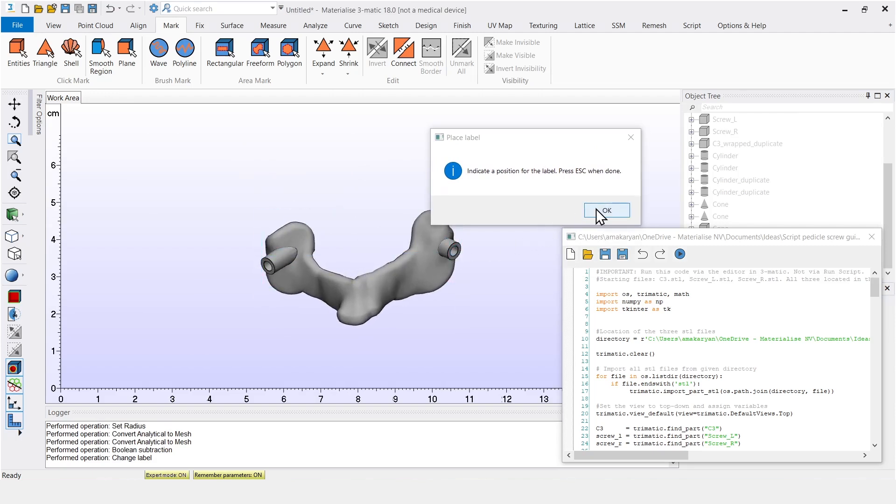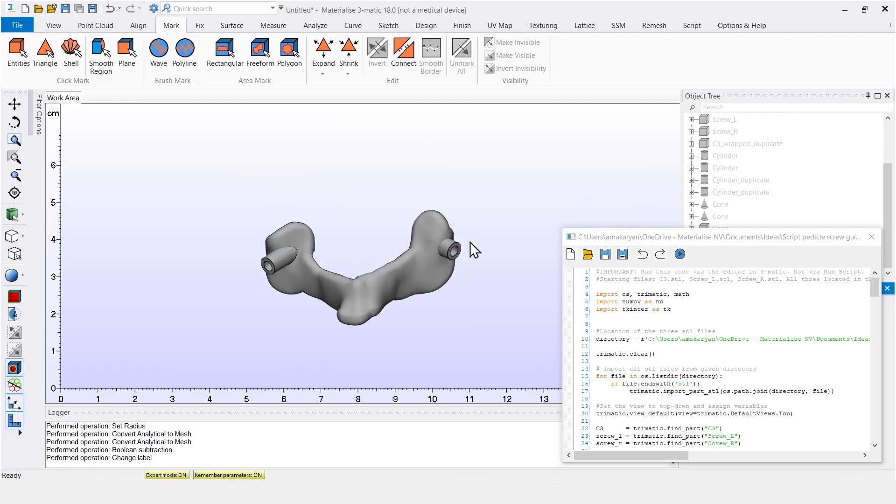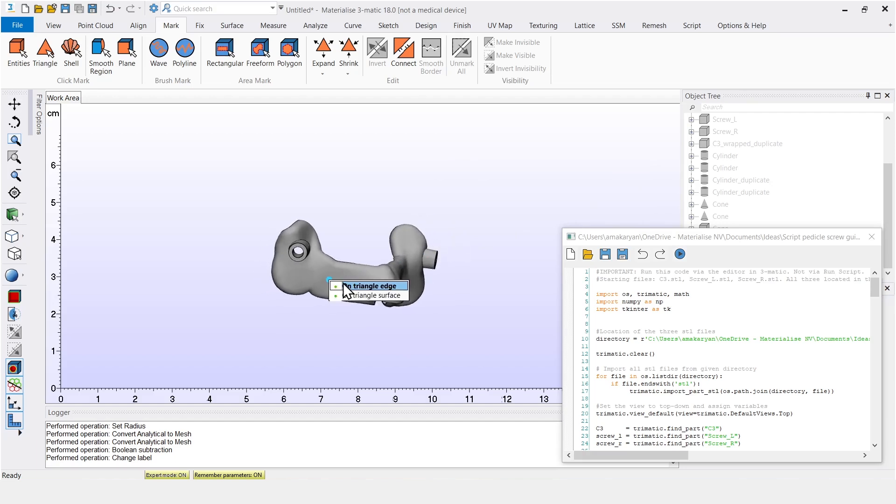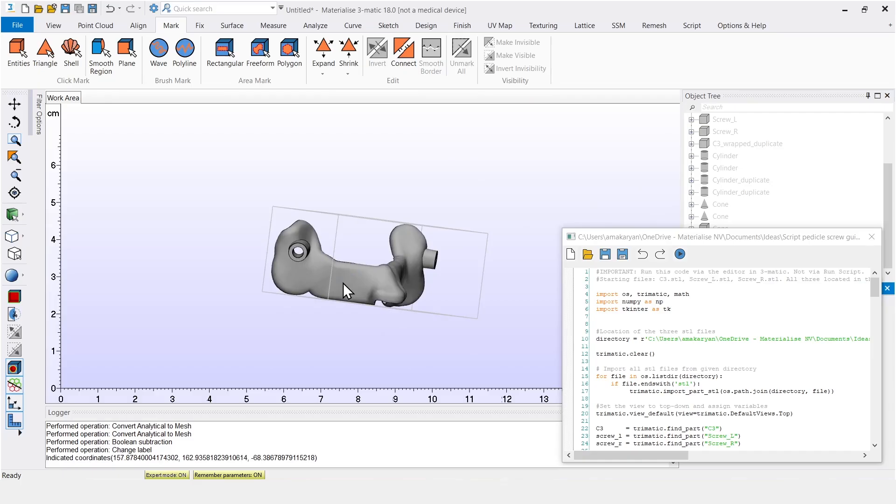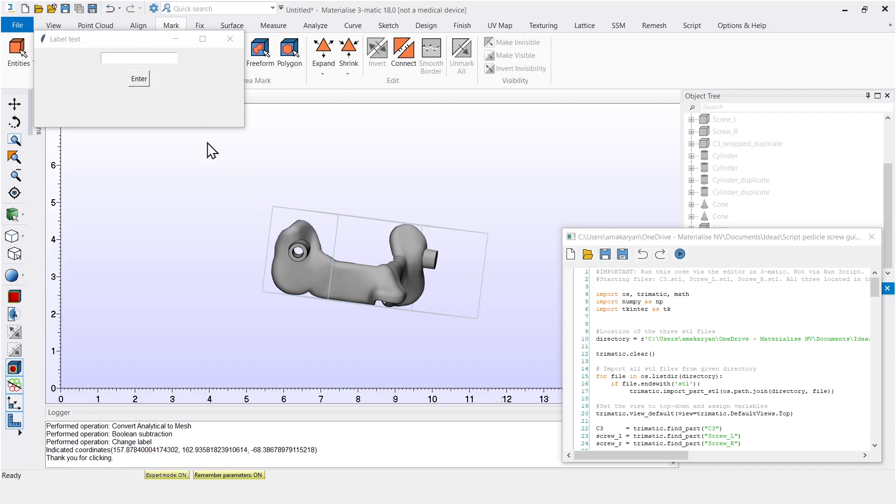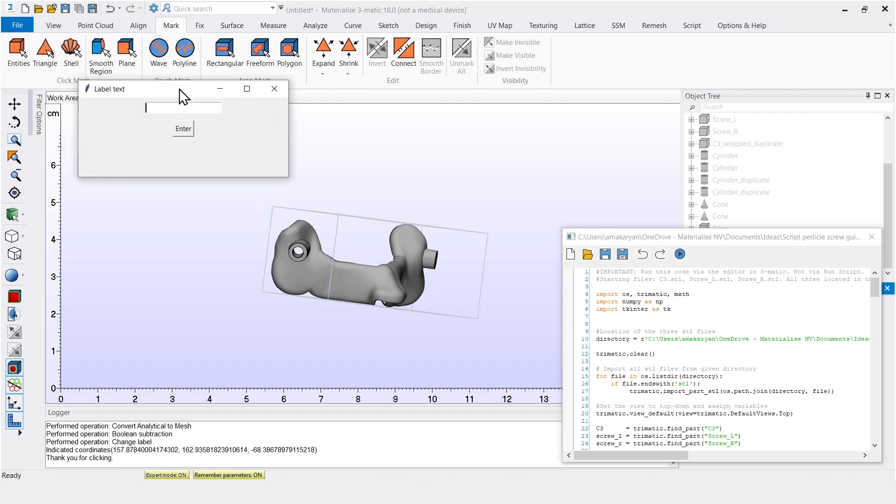Now the script has paused and needs more input again. I indicate a point somewhere on the surface here and press escape. A window pops up, asking what the label should say. And this flexibility is useful because it allows for workflow automation while retaining the option to perform some steps manually.